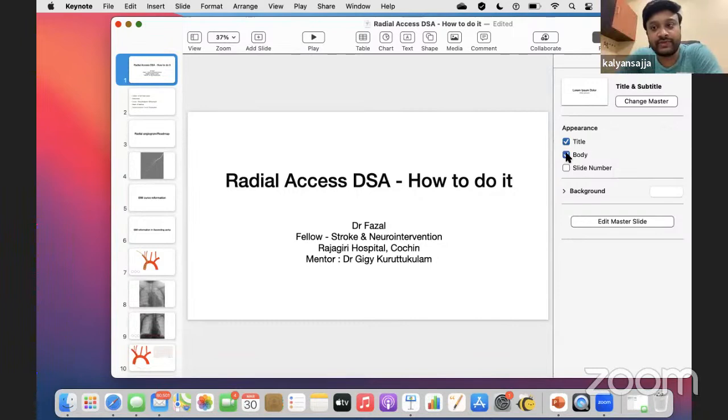The other thing is, if there is a ruptured aneurysm, I only give like 2,000 units of heparin. But I almost always use nitro plus diltiazem. When I was in my fellowship, one of the sites used only nitro, but there did not seem to be a lot of difference in the vasospasm rates.